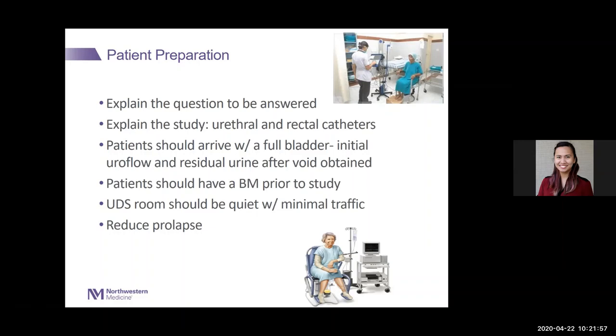It's a very quick test, actually, the actual test part of it. The setup and everything takes longer, especially with neurogenics and things. We ask them to arrive with a full bladder, but if you can imagine that someone has a lot of urgency and frequency, they may show up at the hospital and have to pee, and there's not a whole lot you can do about that.